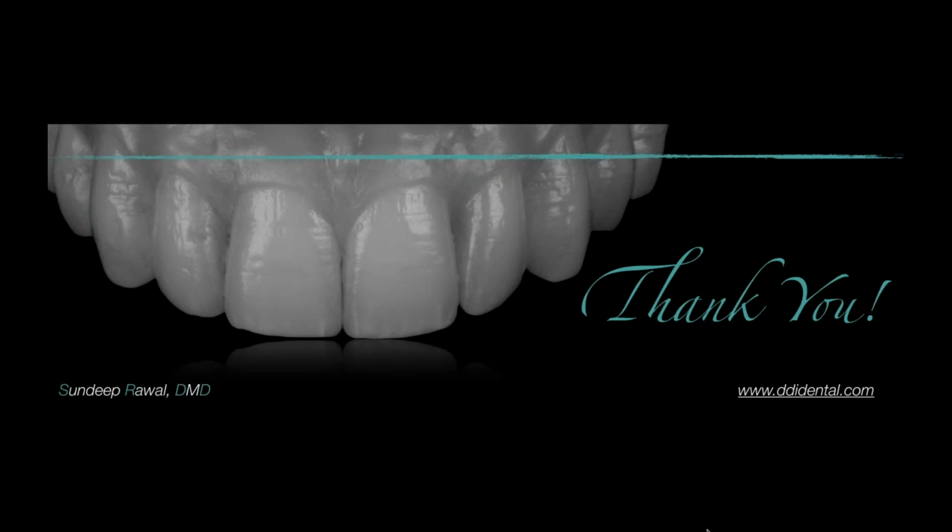What we call that today is static guided surgery, meaning it's one moment in time. You only have the ability to place the implant based off of the plan. If you deviate from the plan, that static resin guide is useless.